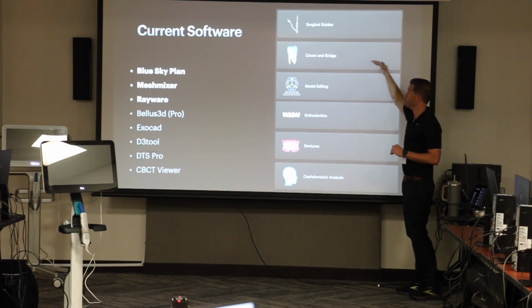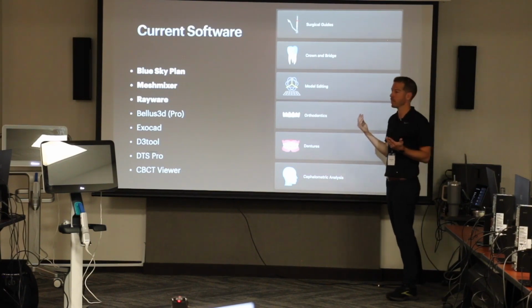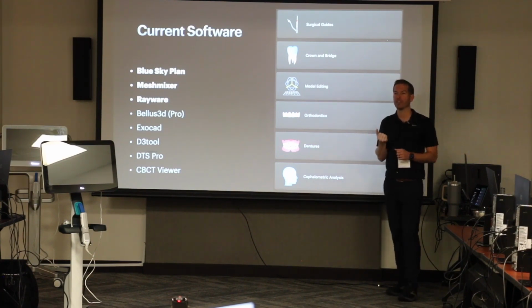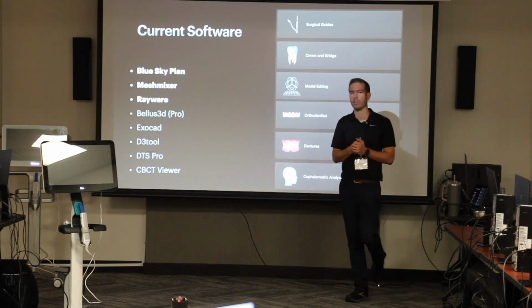But I'll touch on, and this is a free software with paid exports. So the software is free to download, it's free to use, it's free to create things. But to actually pull a surgical guide out that you've created, it costs about $15 to $20, depending on the volume. And so that's your digital overhead to design a surgical guide in the design process.